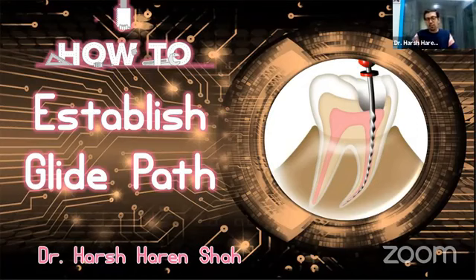I'll be giving a live demonstration of 3 different techniques for establishing glide path in your root canal cases. And I'm not going to be talking about anything that's very complex, very difficult. We are going to start right from the basics. We are going to attend to the simplest cases that we see in our practice, and then we gradually advance towards more complex cases.